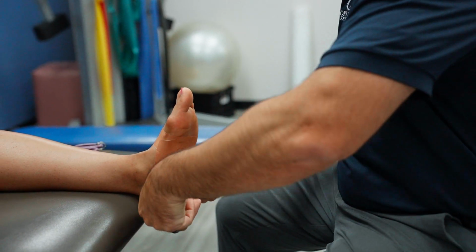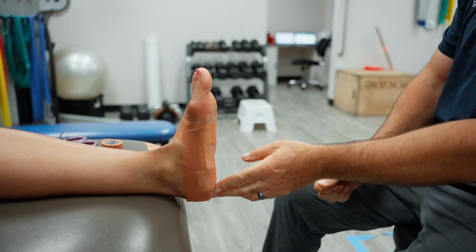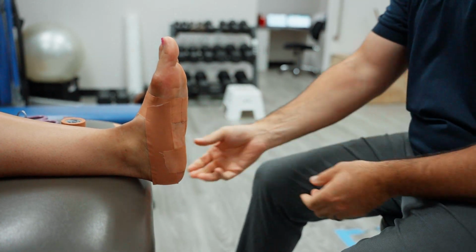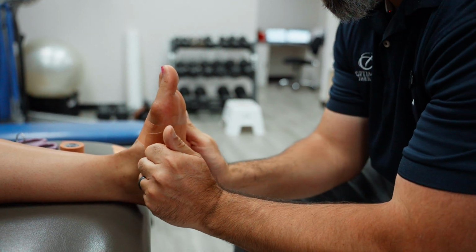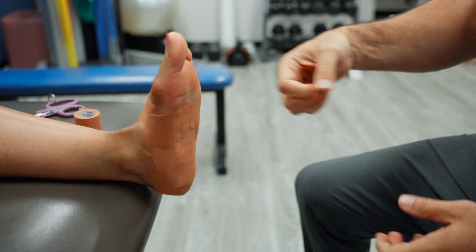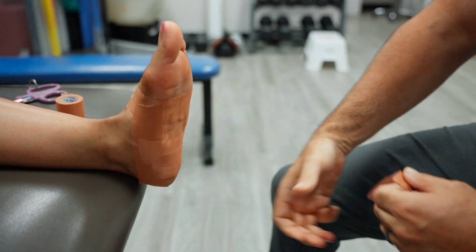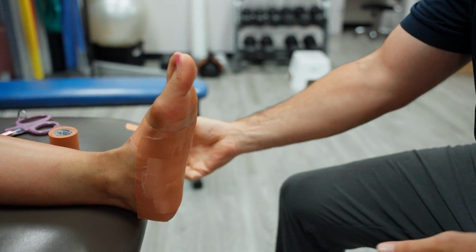Now, I'm gonna start right on the bottom of the heel, about 3/4 of an inch up from the back of the heel. And I'm going to push evenly, pretty hard. So I wanna feel you move a little bit on the table. And then I'm overlapping by half a tape width on each. Like so.